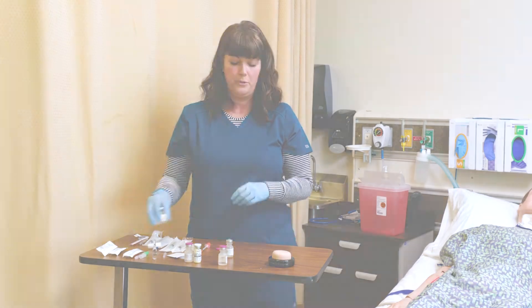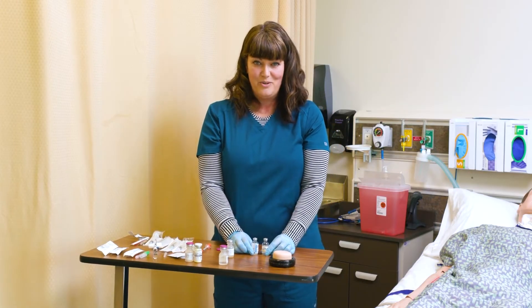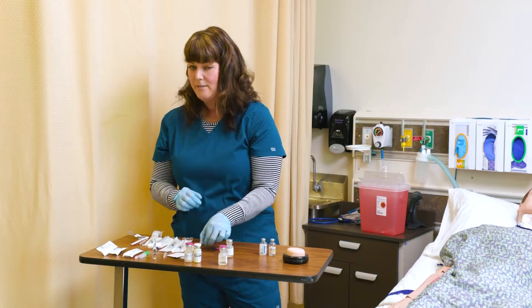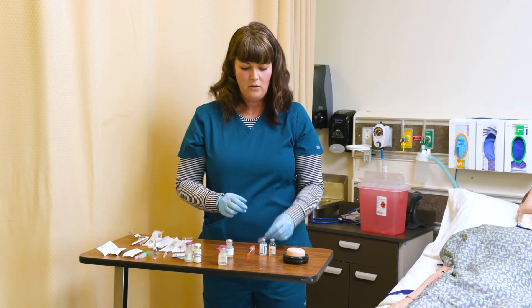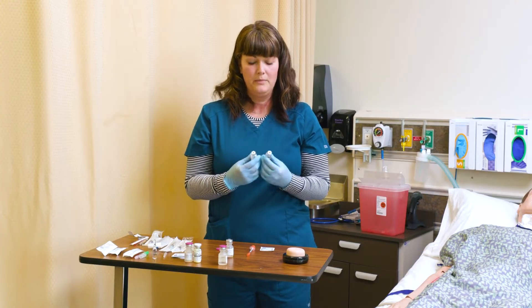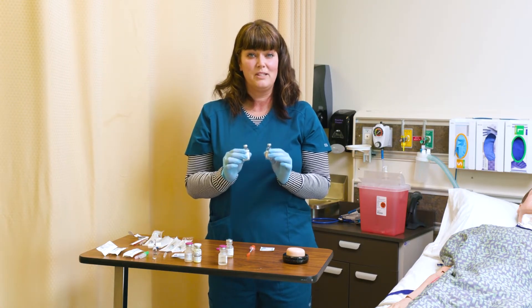Let's demonstrate some insulin for you. One part of a skill you're going to need to be comfortable with is mixing insulin. If I'm going to administer insulin, I have to have an insulin syringe. I have my insulin syringe, my alcohol, and some different types of insulin. You will learn more about this in pharmacology, but I will show you how to draw them up. We have regular insulin and NPH insulin, and we have to draw these up in a very specific order.